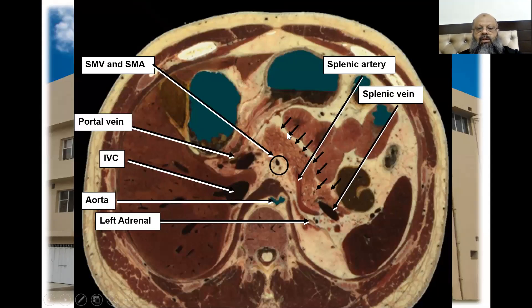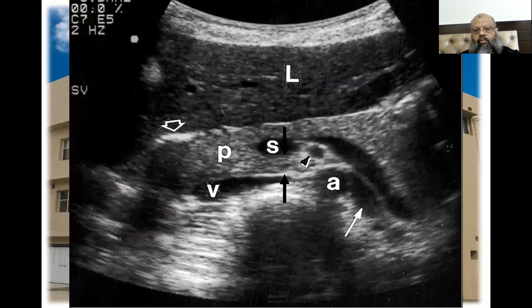Looking at the pancreas structure, we can identify the splenic artery, the splenic vein, the pancreas, the superior mesenteric artery and vein, the IVC, the aorta, and the left adrenal gland. We also see the liver, the splenic vein, and the pancreas head with its neck, uncinate process, body, and tail.